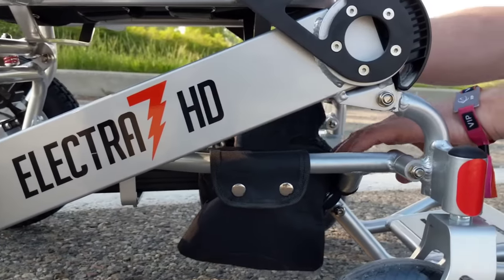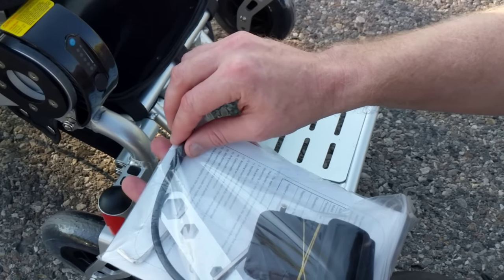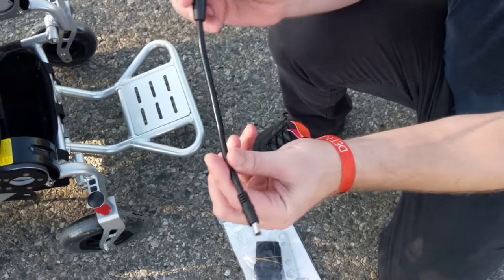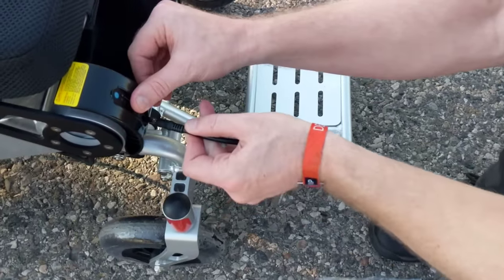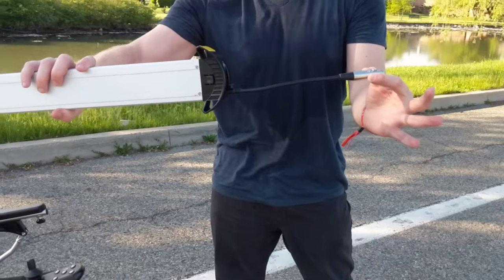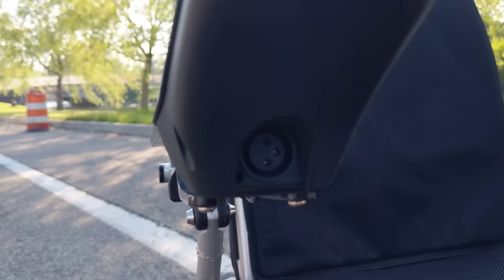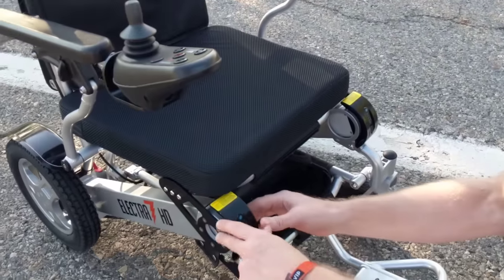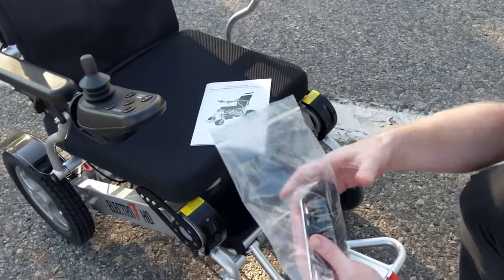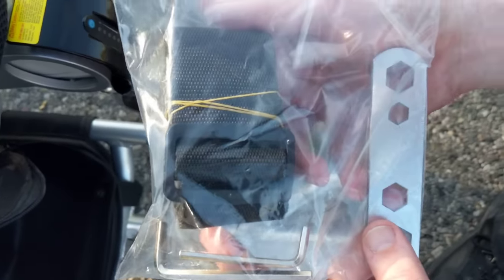With a brand new chair, let's take a look underneath the basket. The chair comes with a safety belt and an addendum to the charger. We can plug this directly into the battery and charge the batteries outside of the chair entirely. The charger also plugs directly into the front of the joystick charging port, giving you the ability to charge both batteries at the same time. And of course we have the Electra 7 instruction manual and every tool you would need if you purchased a headrest or another add-on for the Electra 7.